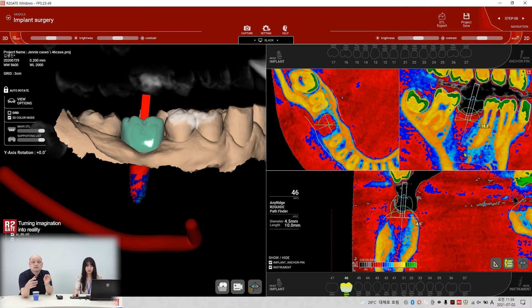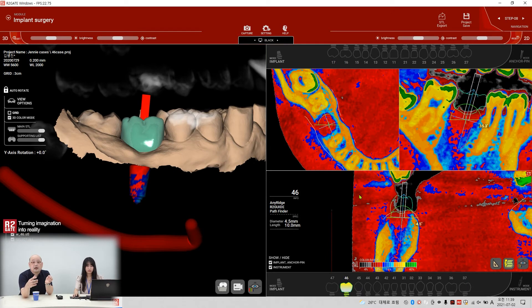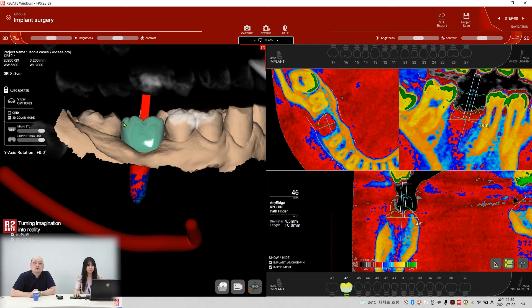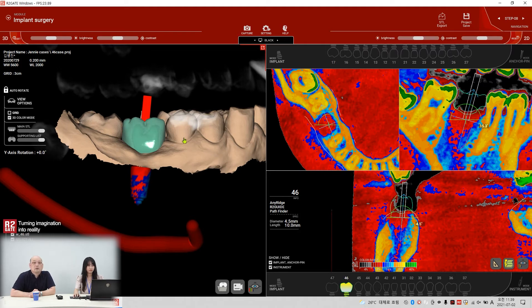But I think — what's the size? 4.5? Yeah, I think this is enough. It's done. This is implant planning. So what's next?